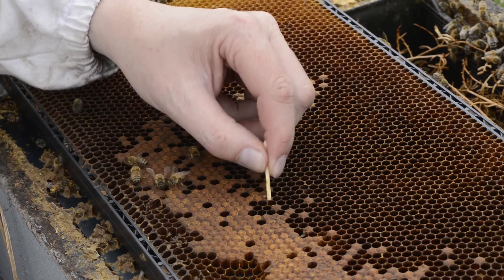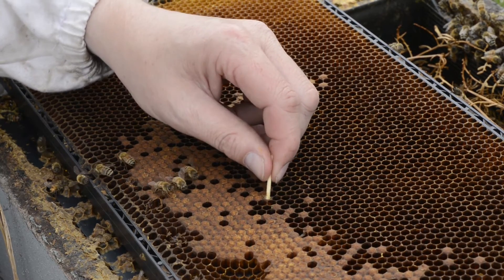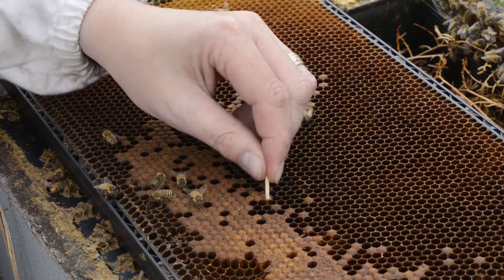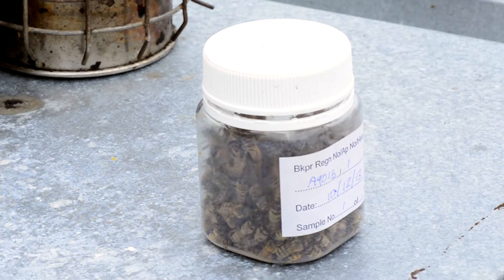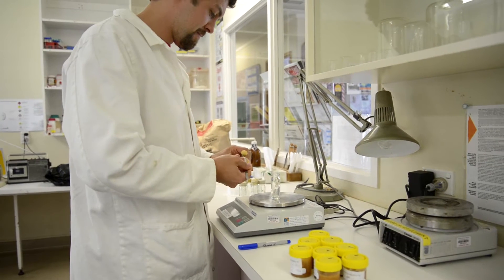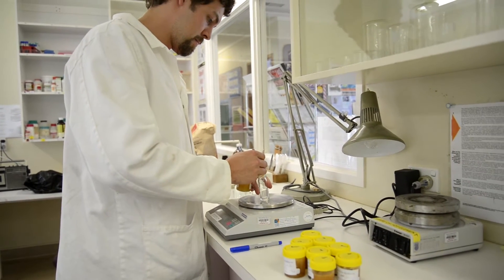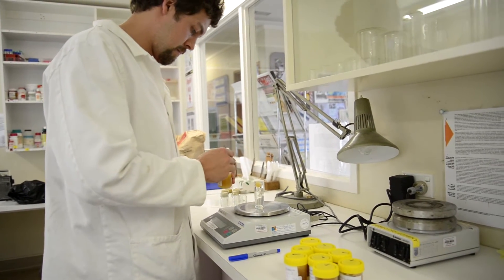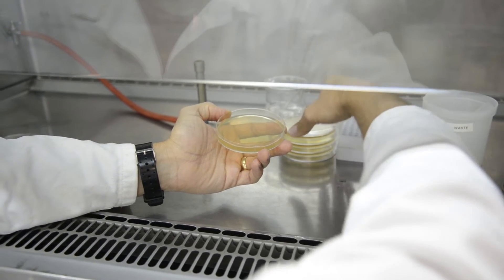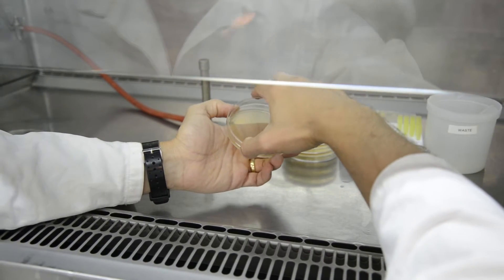We test three sorts of samples in the lab. The first is larvae — where a beekeeper has looked at a larva, thinks it might be American Foulbrood, and needs the diagnosis confirmed. The second is adult bees, to see whether they're carrying spores. The third is honey. We don't test pieces of comb, mainly because we don't know how diagnostic the results would be.